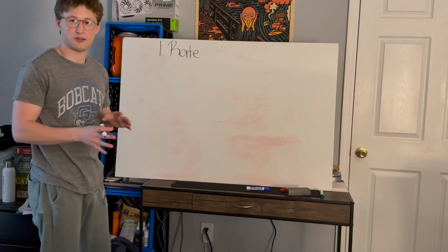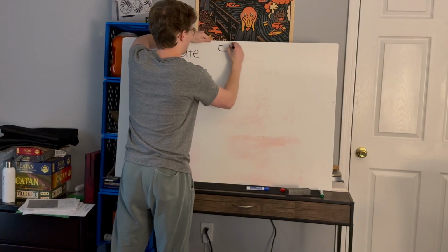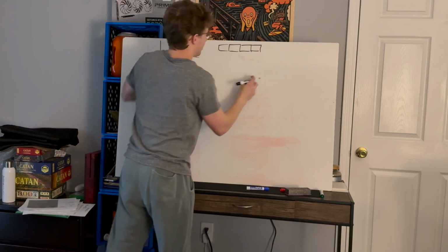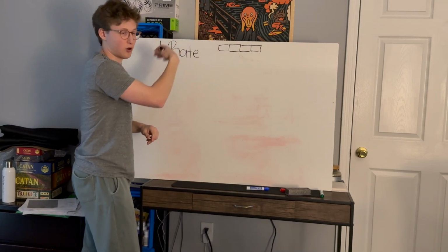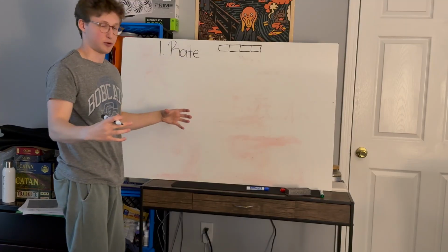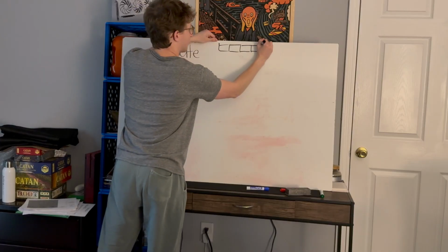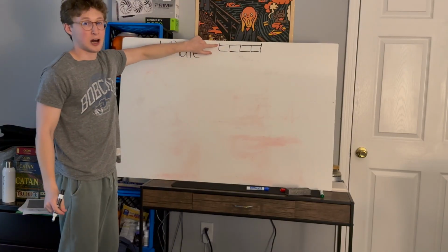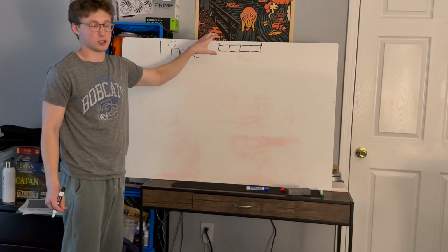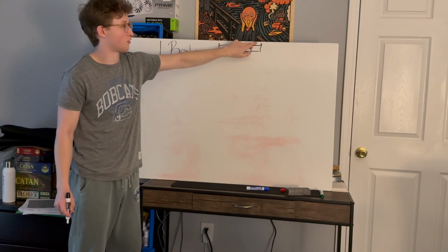When you're looking at an ECG strip, you have a bunch of large boxes. They all have small boxes in them. Depending on if you have the strip printed out or not, there will actually be little ticks like that on top. This is not an accurate representation of how many large boxes are between each of those ticks, but you'll see these ticks.